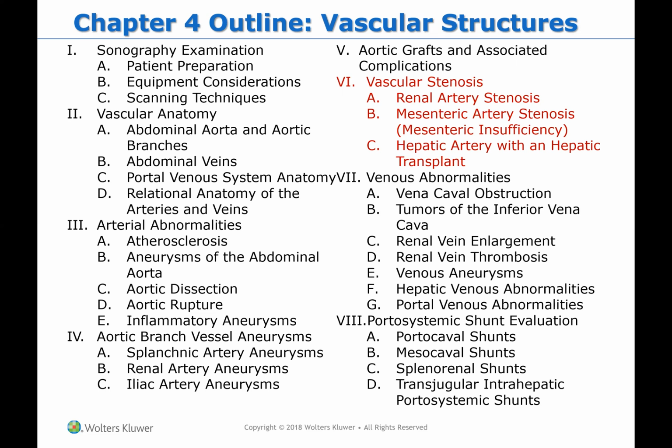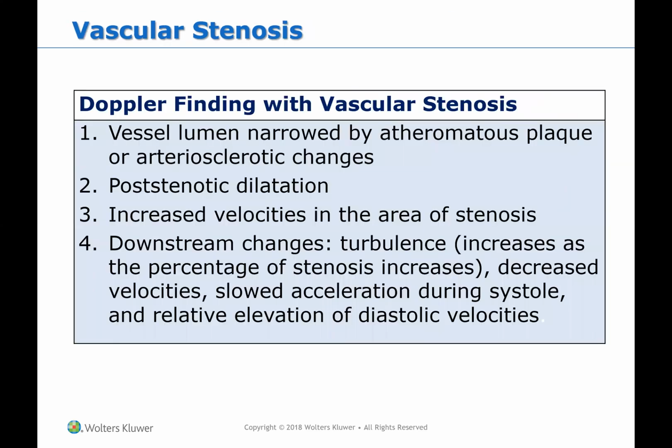We do a lot of vascular work for stenosis. And we're going to talk about the most common one that we do, which are renal artery Dopplers for renal artery stenosis. So basically, stenosis is where the vessel lumen is narrowed by plaque.